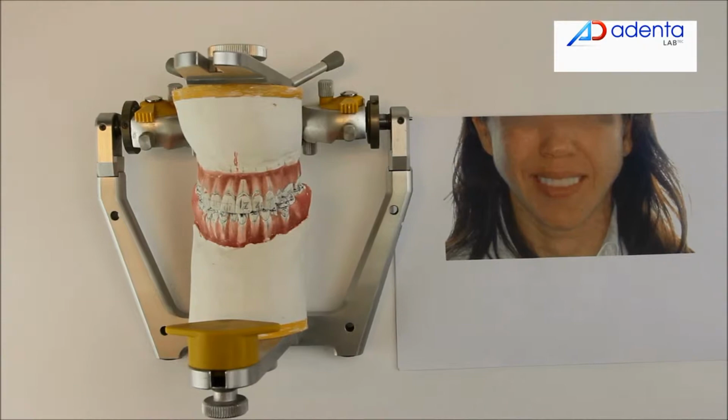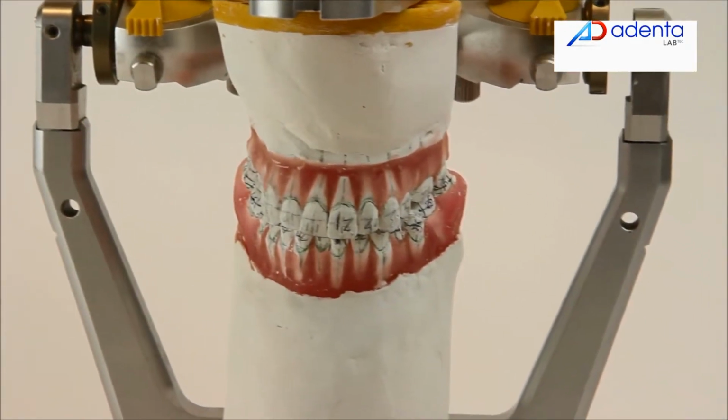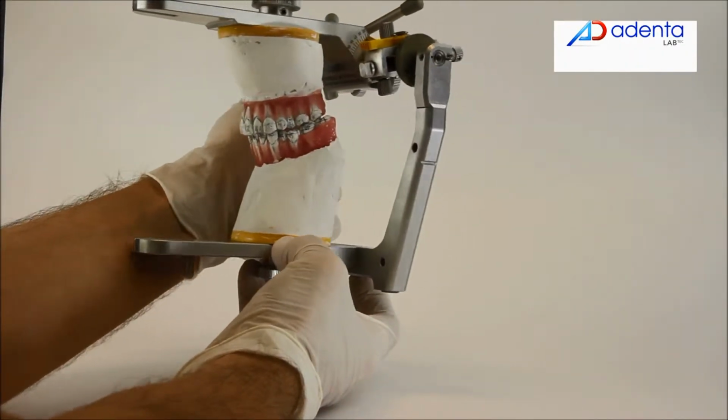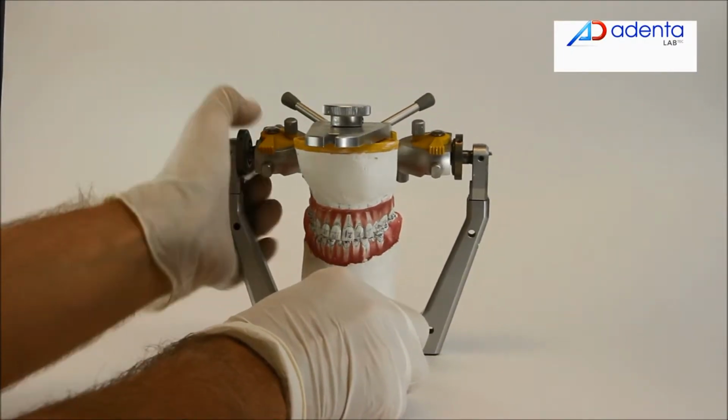Draw the reference lines, the facial midline and the smile line, on the setup models carried out with Model Maker. Put the articulated models in the articulator you usually use. In this case, it is SAM3.